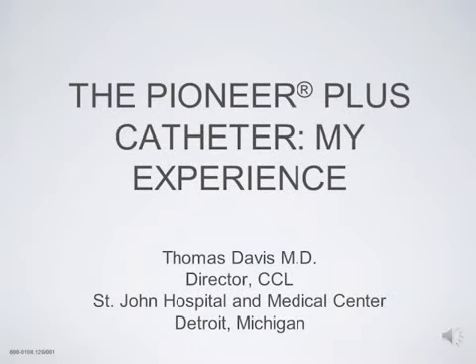This is a lecture on the Pioneer Plus catheter, and this is going to be my experience with this over the last several years.